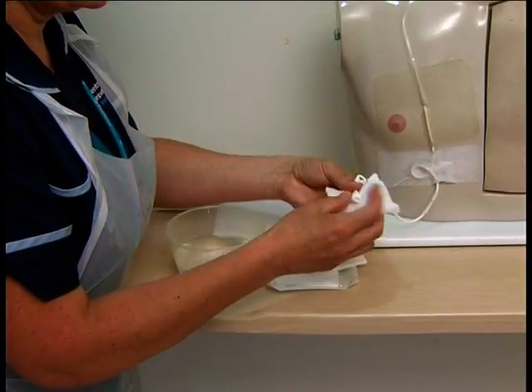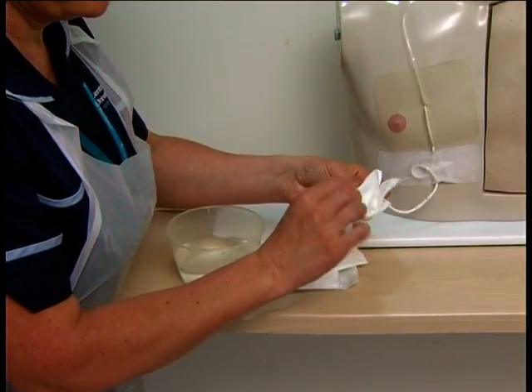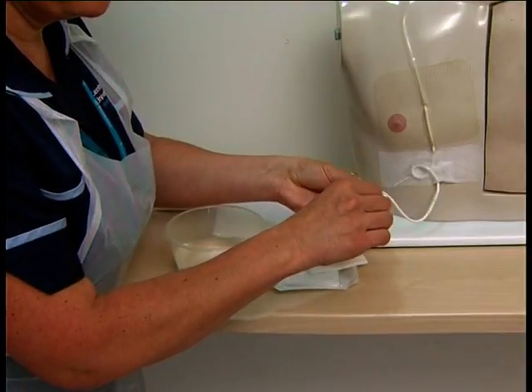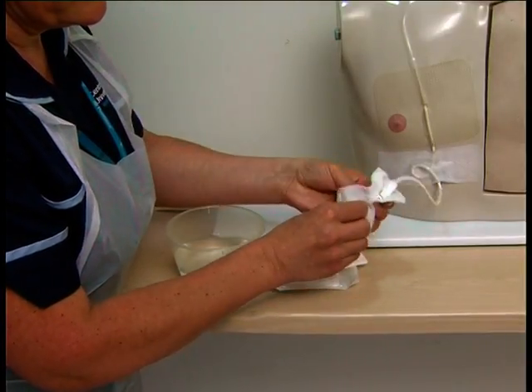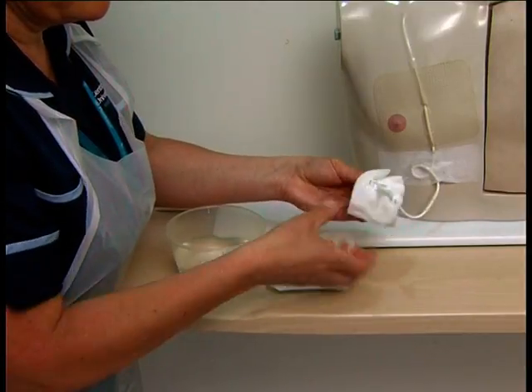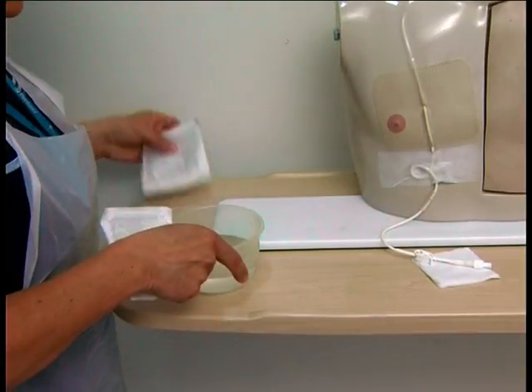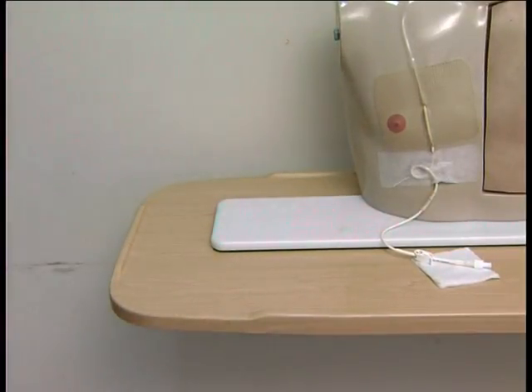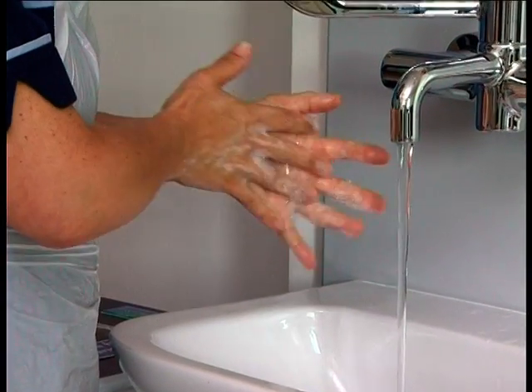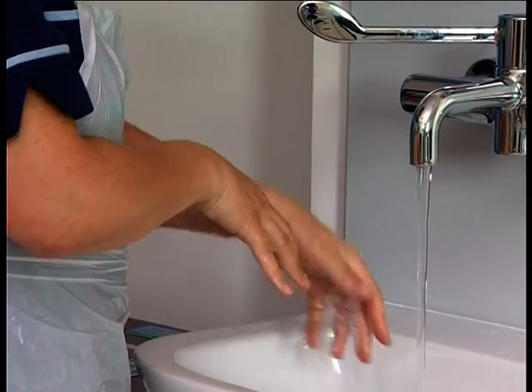If the CVC is visibly dirty, or you know that it has been contaminated, for example in bath water, with stool or vomit, cleanse the CVC using gauze swabs, a clean bowl, warm water and washing up liquid, as previously shown in part 1. If you are confident that the CVC is clean, you can proceed to prepare your trolley. Wash your hands as before, to make sure that if they were contaminated whilst cleaning the CVC, they are clean before you commence the procedure.